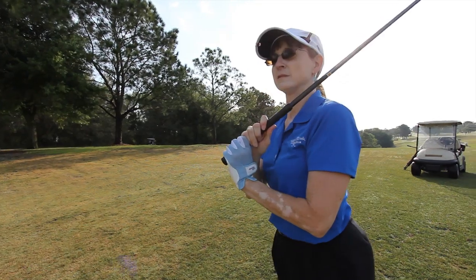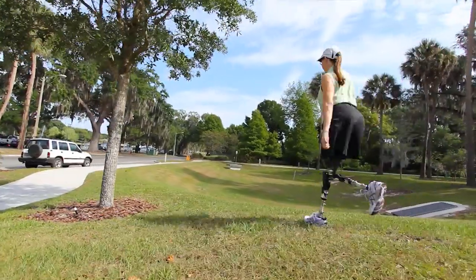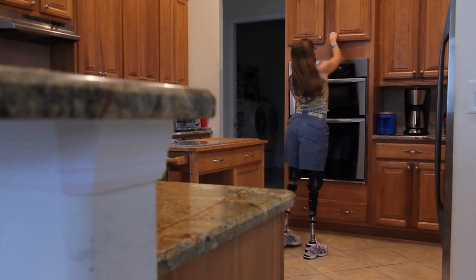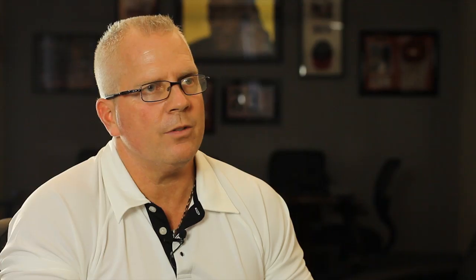For patients that are active, those patients really want to have a knee that's going to keep up with them, that's not going to restrict them, and that's very user-friendly for them. That's why we chose the Plie for Zee.